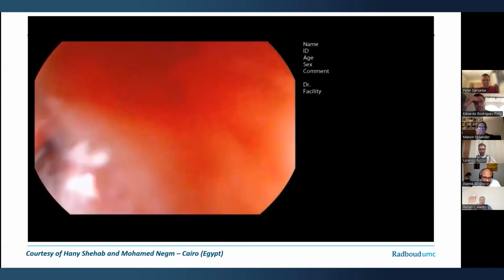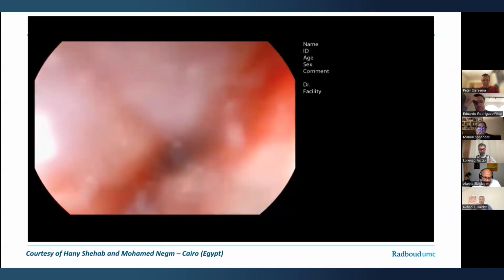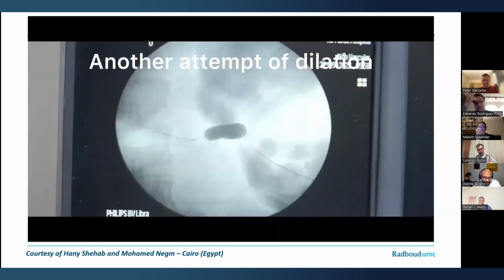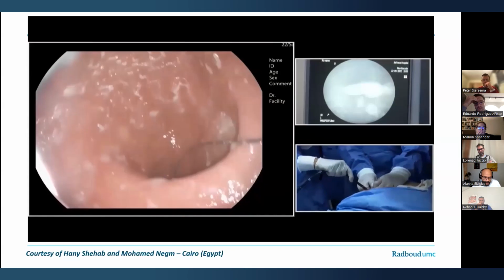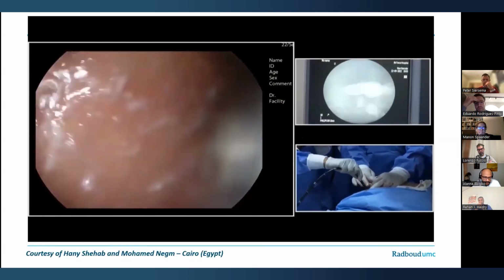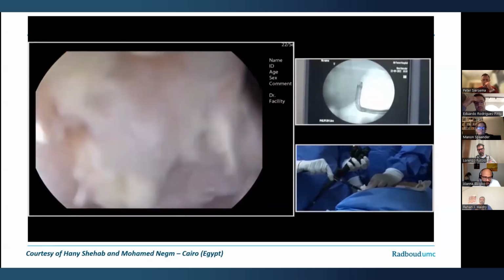Yeah, it's almost next to impossible, but you're doing a good job. It just needed 2 people to get it in. So the first hurdle is to find the cardia in this inverted position. Yeah, this is our direction.